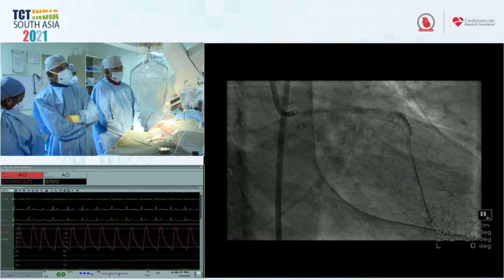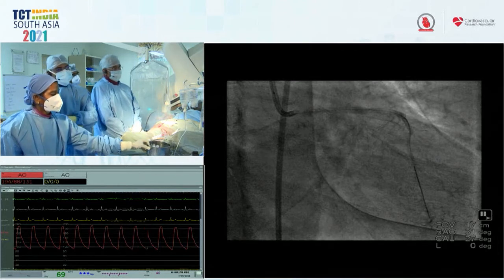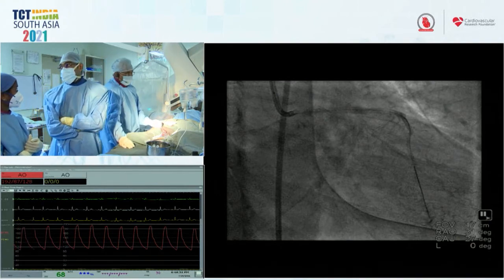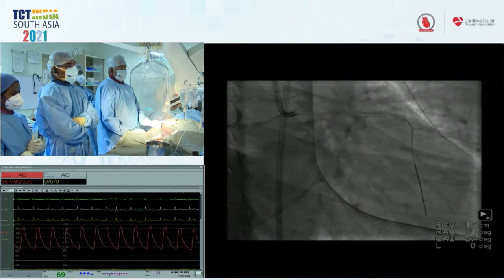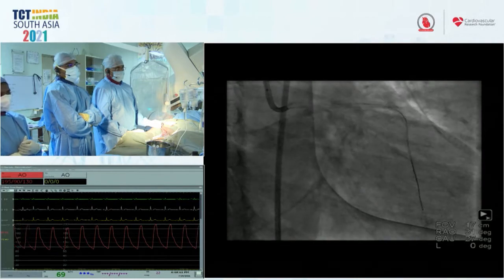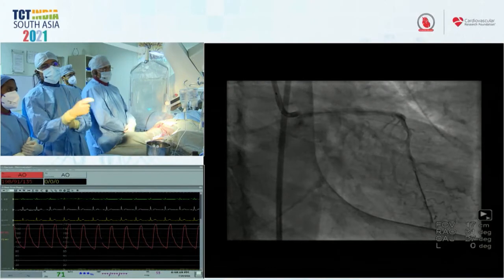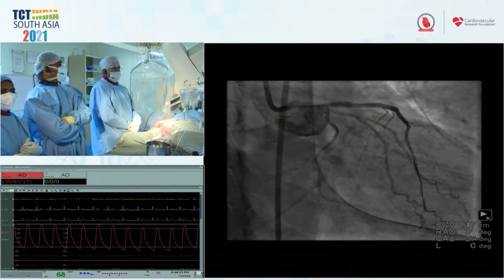But to Ziad's point, if you think you can pull it off, it would be optimal. It really is just a matter of how things line up and your ability to visualize. IVUS marking the ostium and knowing on stent boost where you are may be ways to get that to happen where you don't miss on either side. I think the key here is to use the imaging to make sure that you have the length. As Dr. Ziad said, since there is at least 2 millimeters of stent already in the left main, it may be possible to just overlap that without jailing the circ.